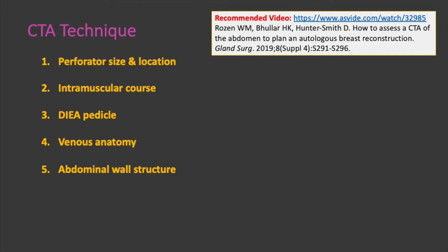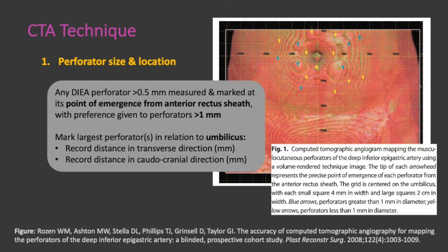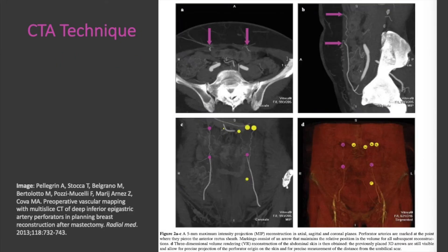The list shown here highlights the data points of interest. For step 1, perforator size and location: any DIEA perforator greater than 0.5 millimeters should be measured and marked at its point of emergence from the anterior rectus sheath. Preference is given to perforators greater than 1 millimeter. You should mark the largest perforator in relation to the umbilicus in both transverse and caudocranial directions. This figure shows a maximum intensity projection reconstruction in the axial, sagittal, and coronal planes. Perforator arteries are marked at the point where they pierce the anterior rectus sheath, and 3D volume rendering reconstruction of the abdominal skin is then obtained. The previously placed arrows allow for precise projection of the perforator origin on the skin for measurement relative to the umbilicus.